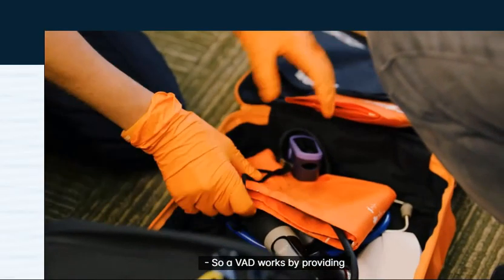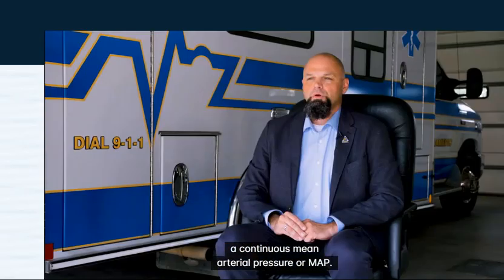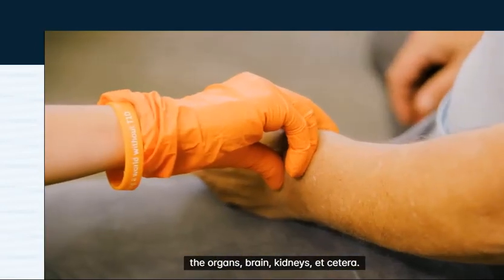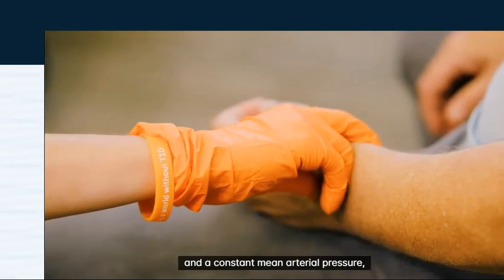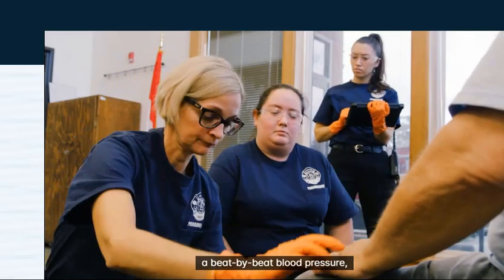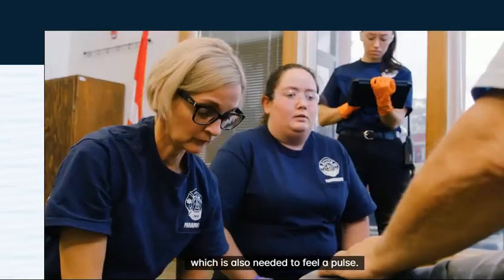So a VAD works by providing a continuous mean arterial pressure, or MAP. The MAP essentially is what's needed to perfuse the distal tissues of the body, the organs, brain, kidneys, etc. Because a VAD delivers continuous flow and a constant mean arterial pressure, blood pressure may not be measurable. Because a patient doesn't have a beat-by-beat blood pressure, they will not have a systolic or diastolic pressure, which is also needed to feel a pulse.